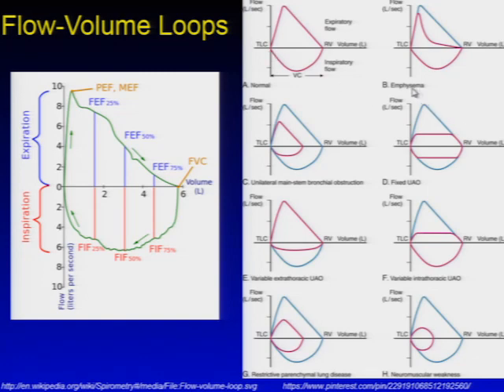Now, when you have a patient with emphysema, which is a mid-airway disease, you will see the same rise but slightly decreased flow. But the most pronounced part is here, the decreased flow speed of the mid-air portion, represented by FEF 25 to 75%. That's the typical decrease you may see for the emphysema patient.